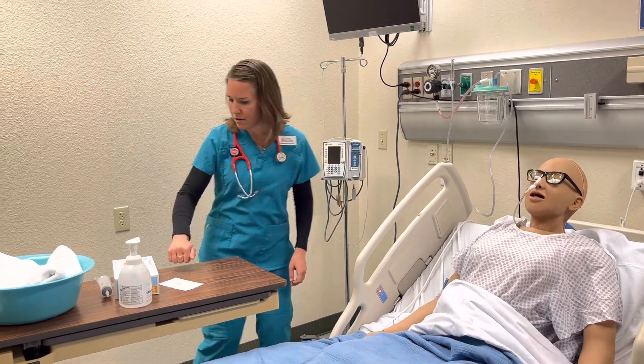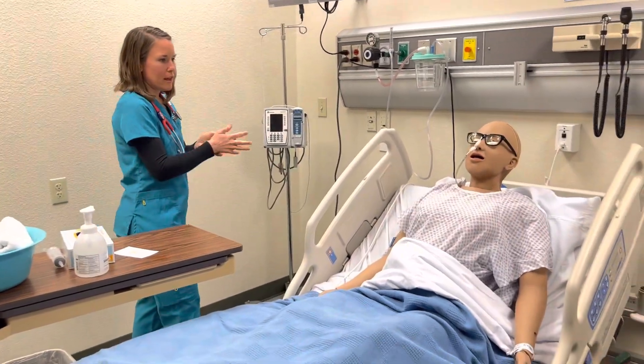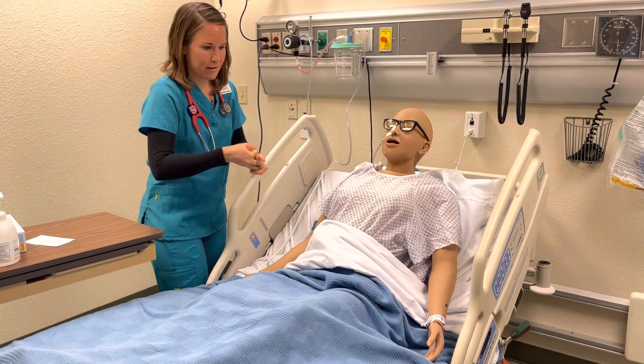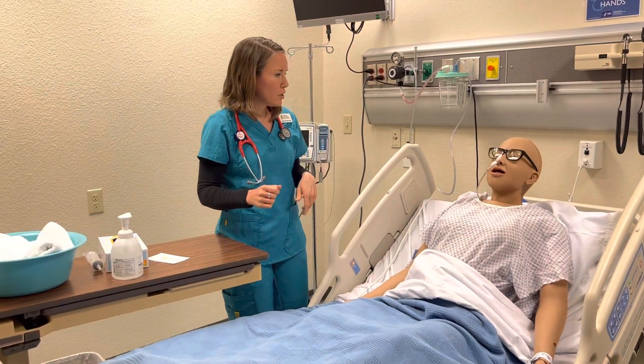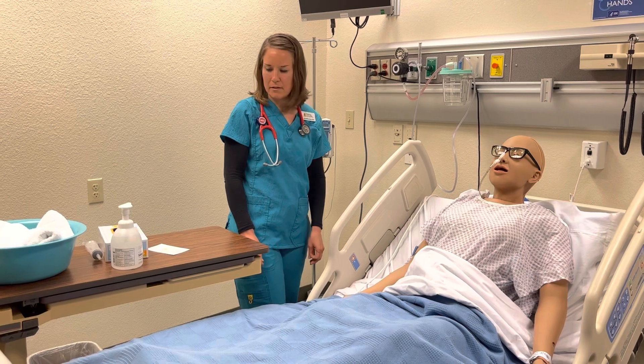So I'm going to come in. Hi there, my name is Ms. Keesley. I'm going to be your student nurse today. Can you tell me your name and date of birth? Jasmine Cavalin, March 4th, 1980. Excellent, that matches. And do you have any allergies, specifically like to latex or adhesive? No, I don't. Okay, sounds good.